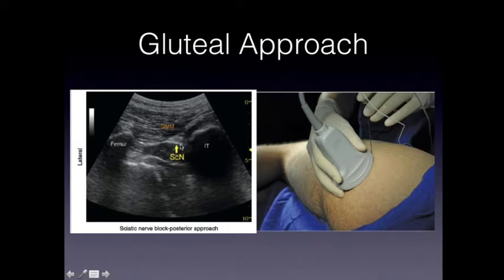And the important thing is that the sciatic nerve is in between the bone structures, and in order for us to depict the nerve correctly, we have to have a contrast between the predominantly hyperechoic image of the sciatic nerve, which is this one here.